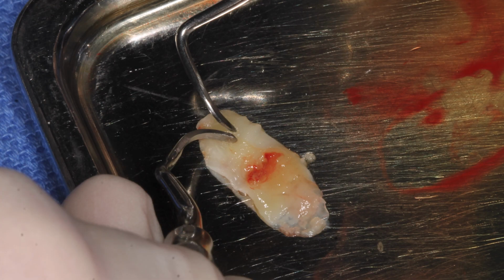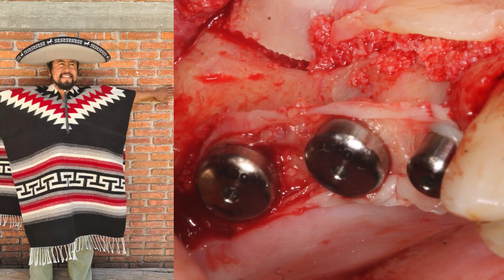We did place some concentrated growth factors not pressed into the sinus cavity, but here is one that is pressed and made flat, and then we're creating a number of holes, in fact 3 holes on this stretched out CGF, because we are creating a poncho, just like this Mexican gentleman in this picture. Poncho where the head pokes through, but the rest of the body stays underneath. And of course, the rationale for this is to try to give as much growth factor and healing potential at the flap edge, which is the most vulnerable of the whole system in the initial days of healing.